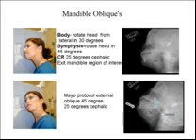Mayo would like a 45-degree angle from the IR also. True laterals are for the ramus. Central ray is directed 25 degrees cephalad from the interpupillary line to exit the mandible on the downside. Each axial lateral oblique projection demonstrates the region of the mandible that is parallel with the image receptor.